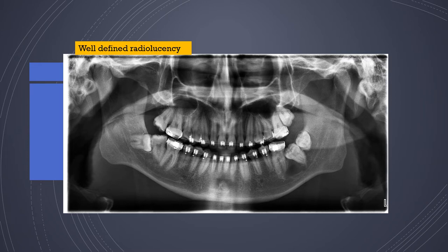Moving on to another radiolucency — this particular tooth in a patient receiving orthodontic treatment. The lower-right 7 is submerged, and the radiolucency associated with it could be an OKC or an ameloblastoma. On the radiograph alone it is impossible to clearly differentiate between the two — histopathology would have to be done for confirmation.